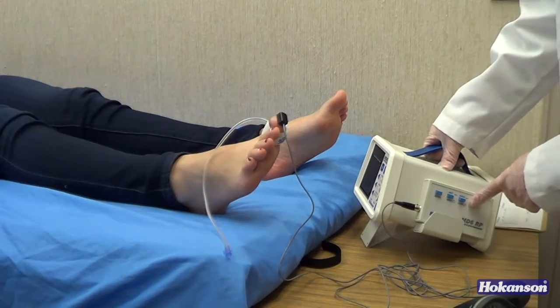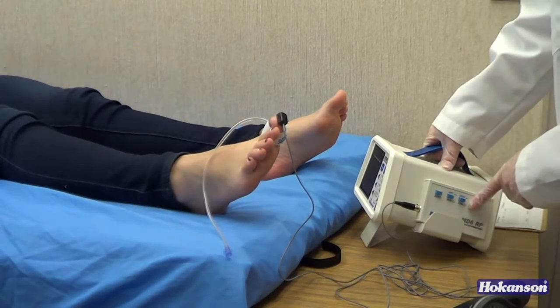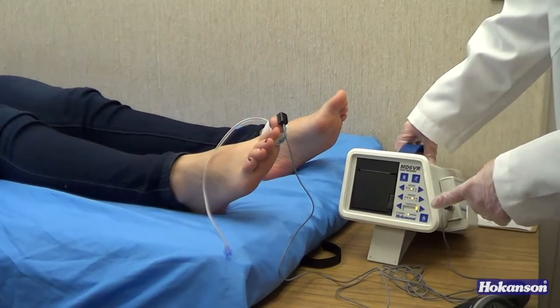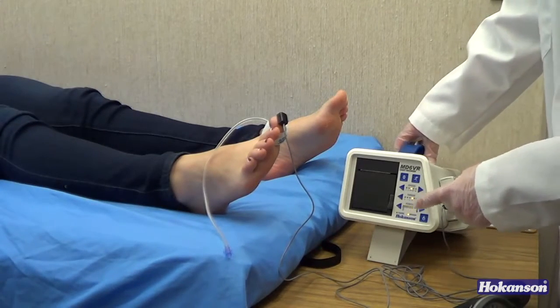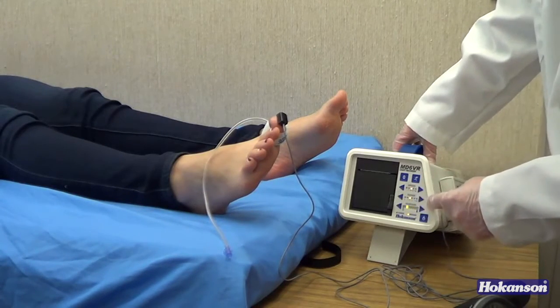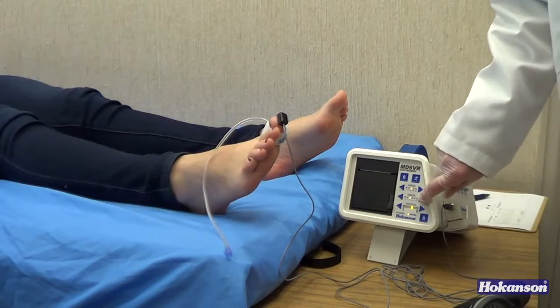The high range or low range setting can be adjusted depending on the size of the patient's waveform. This is a healthy toe waveform, so it's very large and we don't need to adjust it into the high position. We can also make smaller range adjustments with the range button on the MD6VR. The smaller the number, the more sensitive the range.